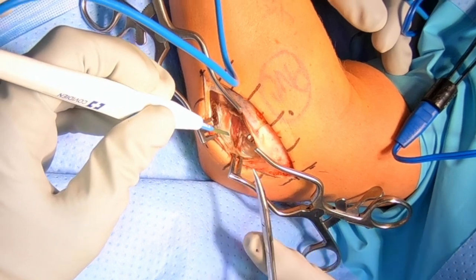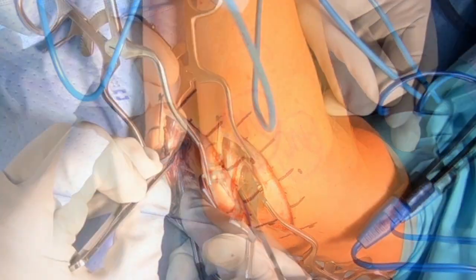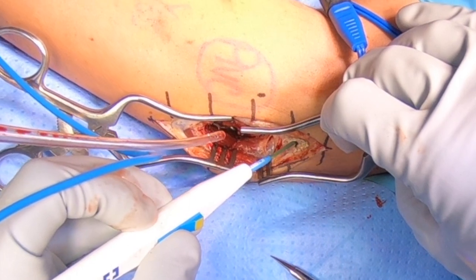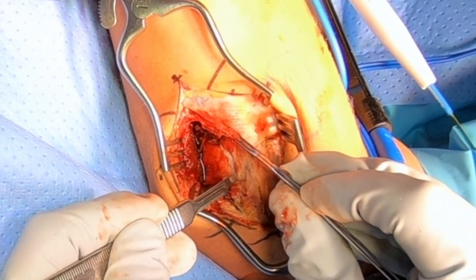Here we're working through the muscle layer and finding our way down to the ligament. The ligament is going to be one layer here below the muscle. This shows us the lower arm bone where the ligament attaches. We're going to continue our dissection here so that we can get the ligament completely exposed. I'm elevating a little bit of the muscle off the surface of the ligament so that I can see down to the ligament.